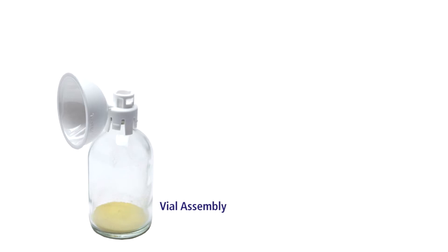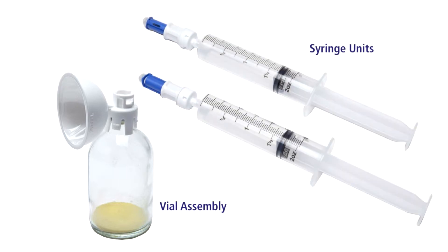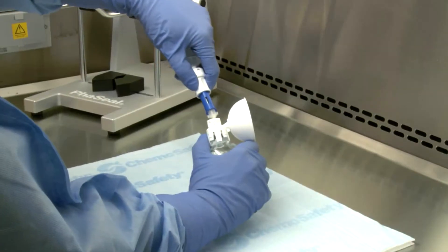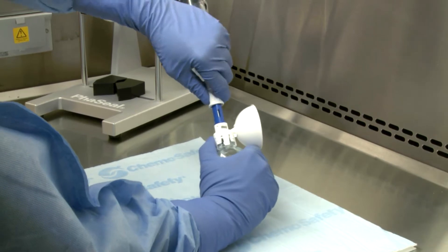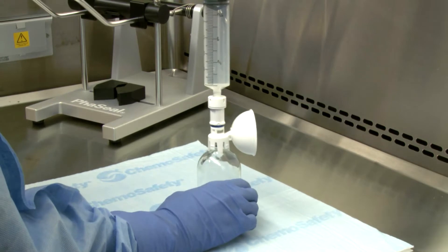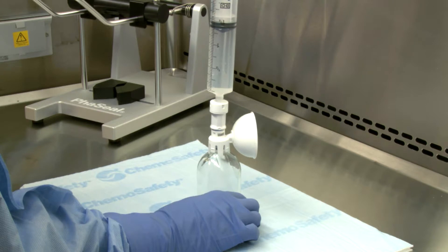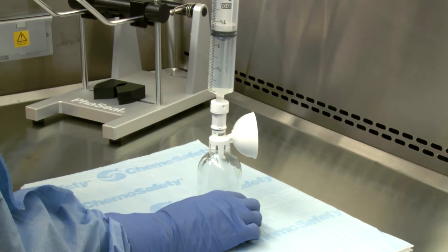We'll demonstrate reconstitution with 100 milliliters of diluent. You'll need a pre-assembled BD-Facile vial assembly and two 60 ml BD-Facile syringe units, each prepared with 50 mls of diluent. Please see the modules on building the vial assembly and building the syringe unit for reference. Engage the first syringe unit onto the vial assembly using the push-turn-push technique. With the vial on a flat surface, inject 50 mls of diluent into the vial. The expansion chamber of the protector will inflate to full capacity.